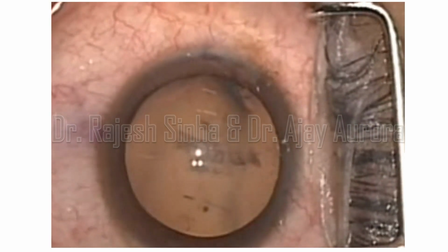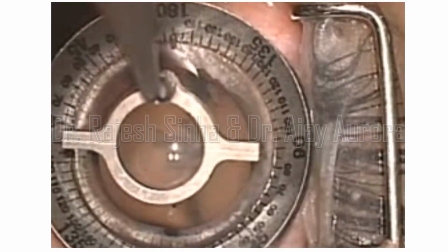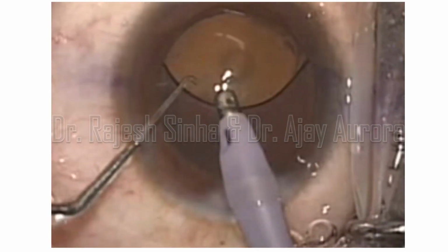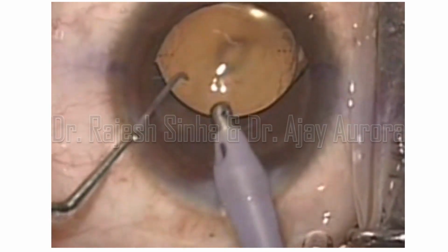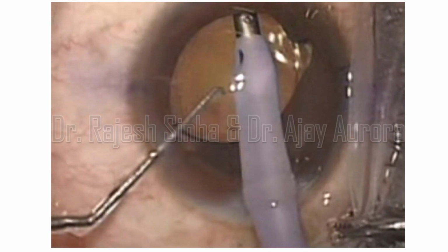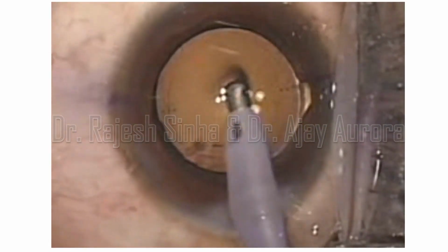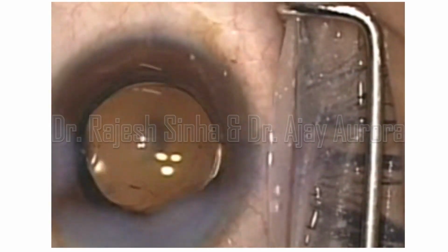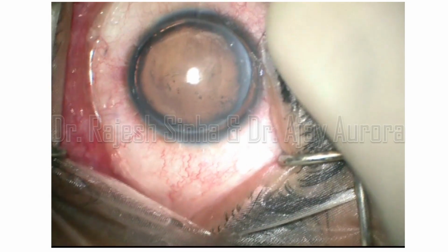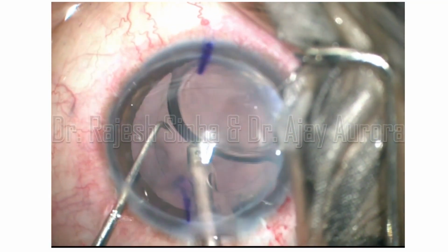Showing some examples, a case of a routine cataract wherein there is pre-existing astigmatism in which a toric IOL is being implanted. What is important is that you should remove viscoelastic from the back of the IOL as well as from the front of the IOL so that the IOL does not rotate in the post-op period. And once you are done with it, you align the axis, and as you can see here, the mark is well aligned.